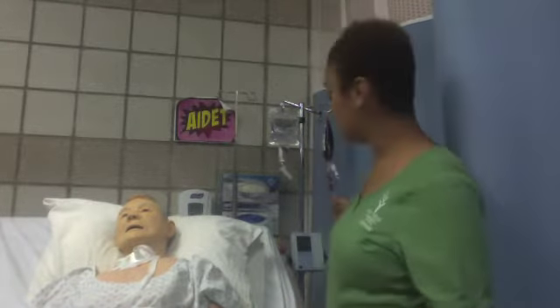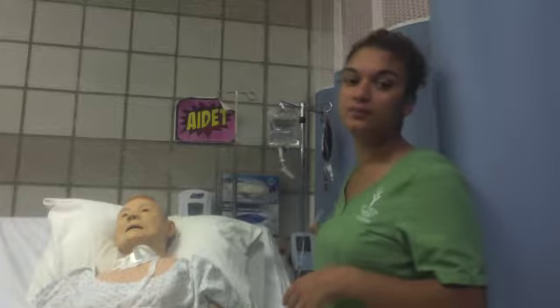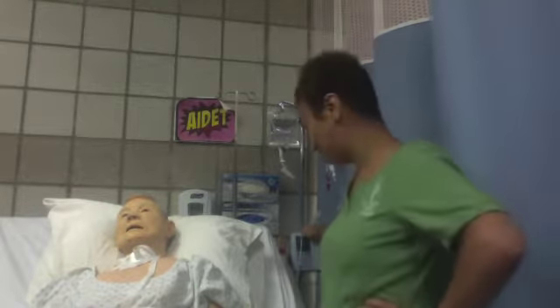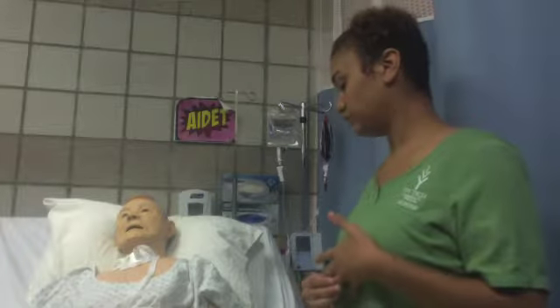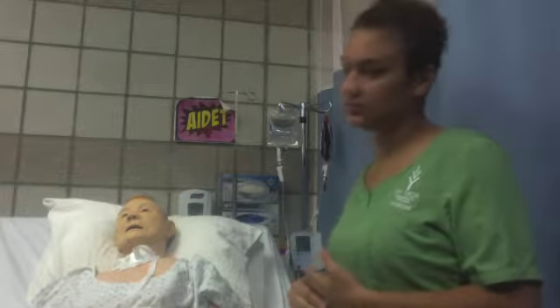But after that, I'm going to go ahead and put my alarm, going to go ahead and set it for the recommended time per my order. And then I'm going to come back often and take vitals, check the site, check for rash, check if my patient is having any of these symptoms listed prior, any fever, chills, redness, itching, rash, any infiltration, phlebitis issues, any infection issues, that the dressing's correct, all the things that I did within that first video.